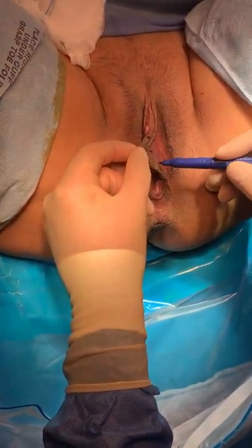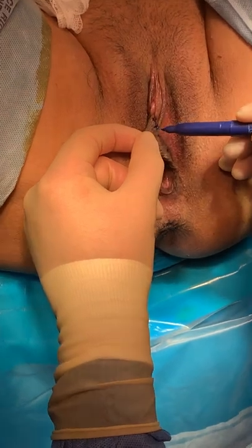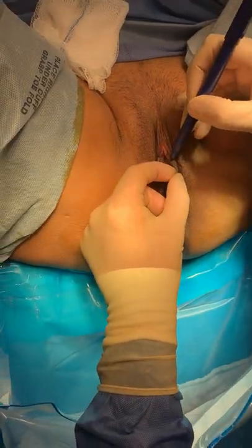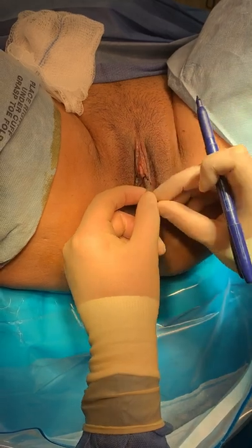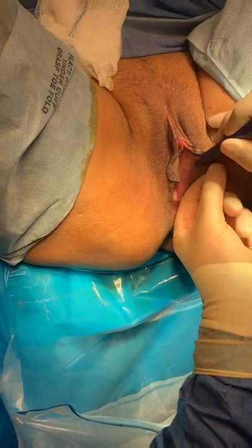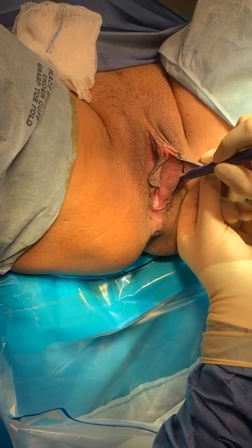I'm just sort of following the color diagram, and I'm going to come down, so I'm going to resect this whole area, and I'm going to come up on top. I formed a little triangular incision on the top, and I'm going to come back down. I'm really sort of gauging — just because I do this all the time, I can get a pretty good idea of where I want to go, but this is about right for her.